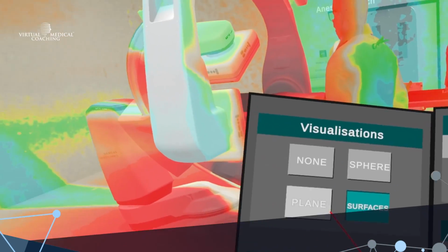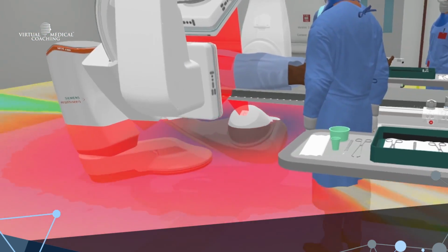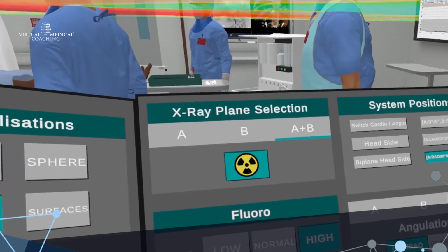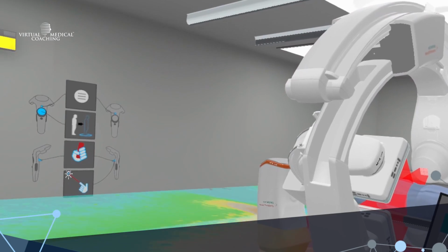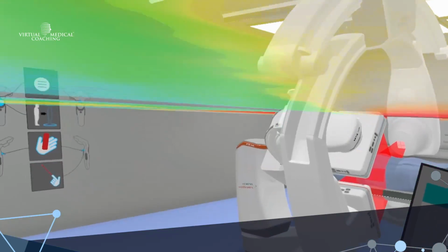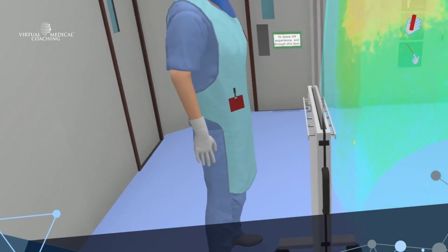Now, if I'm a radiographer, or a cardiologist or a radiologist, I'll know what positions to put these tubes into, but we've also got some presets for the people who don't work in there all the time, and they are the most common presets per operation. We show neurology, hepatology, and cardiology. So there's some different environments. And you can also turn off the colors and see if you actually have learned anything at the end.